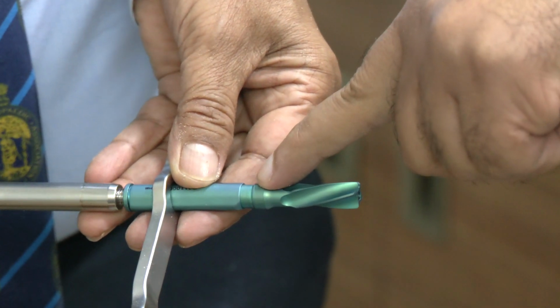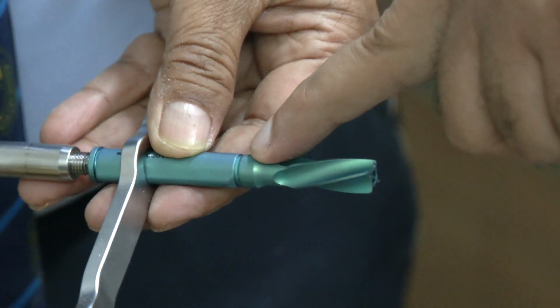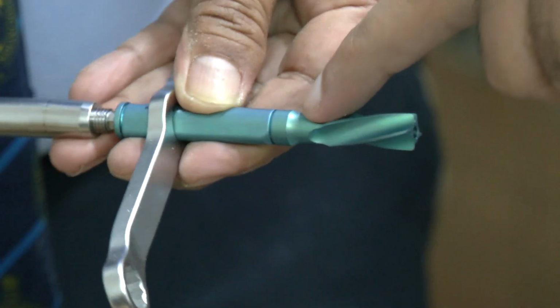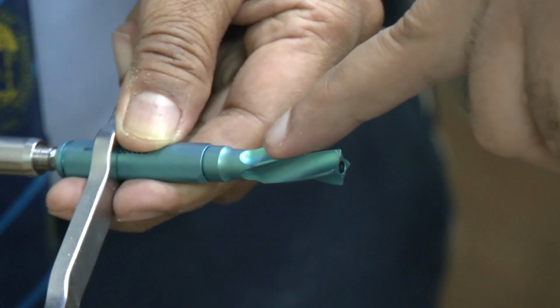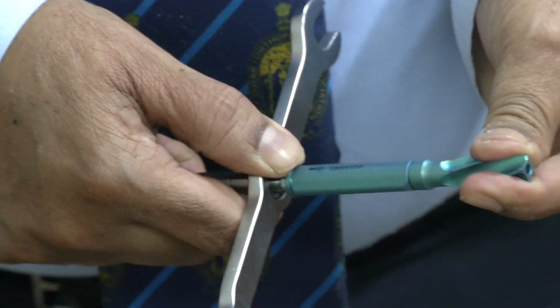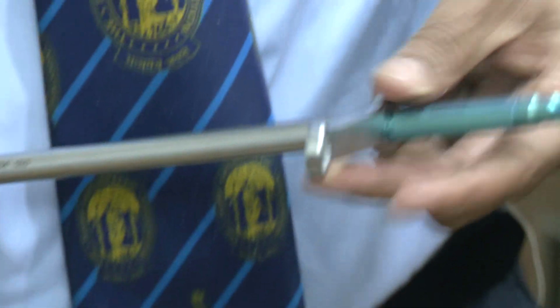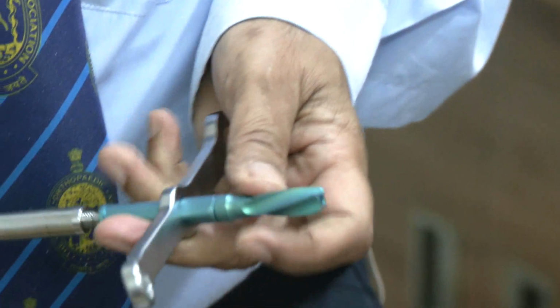There you can see that the gap is becoming less and less. And at the end, once I have tightened it totally, now you can see that this helical blade cannot move and it is locked properly. Normally what happens, the mistake, I will show that mistake also.